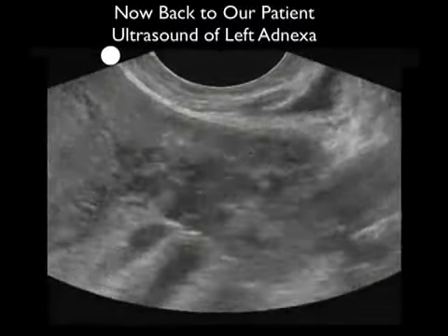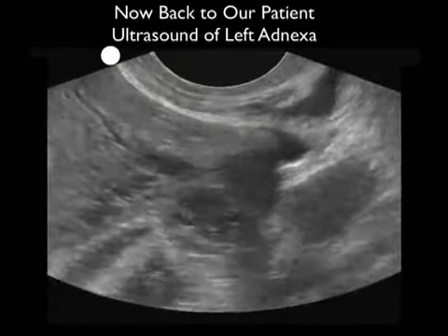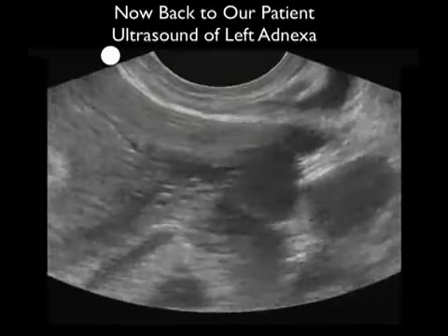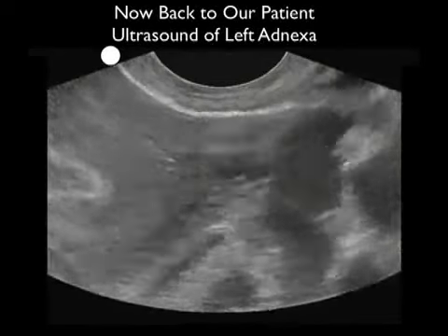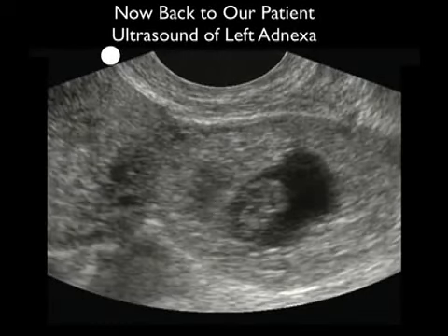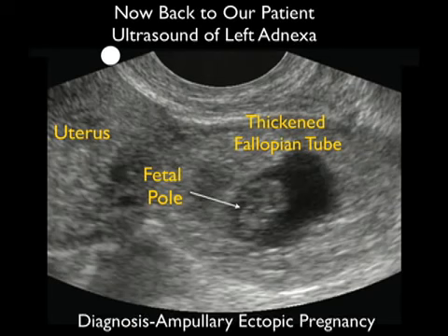So, returning to our case, given the presence of a positive pregnancy test and the absence of an IUP on bedside ultrasound, we were very concerned about ectopic pregnancy and decided to scan out to the left adnexa. Here, notice we're scanning out to the left adnexa and we have a positive finding. What we see here is a thickened fallopian tube comprising what is known as the bagel sign. And notice within the thickened fallopian tube we have another positive finding. That is the presence of a fetal pole. So, in this patient, we were able to diagnose an ampullary ectopic pregnancy, and our next move was to call OB-GYN stat for a consultation.